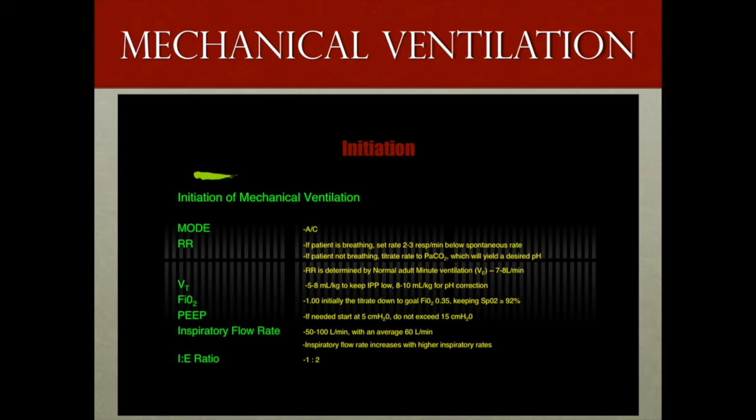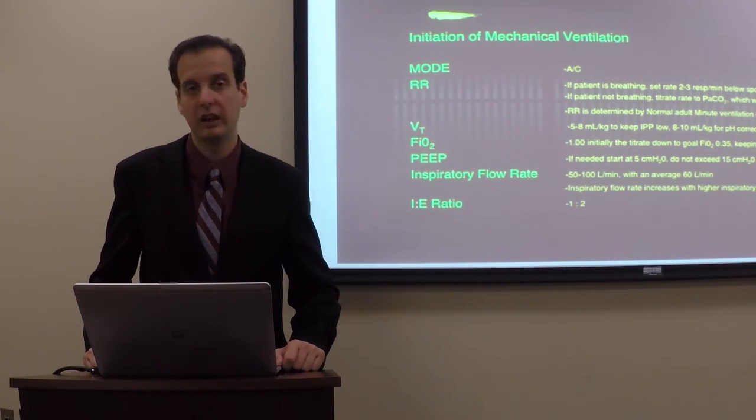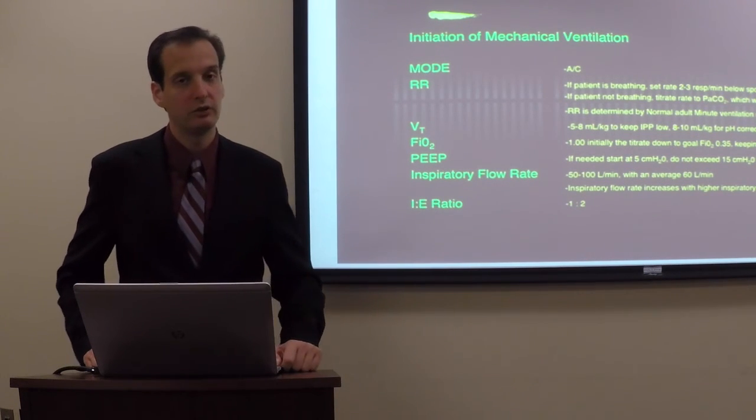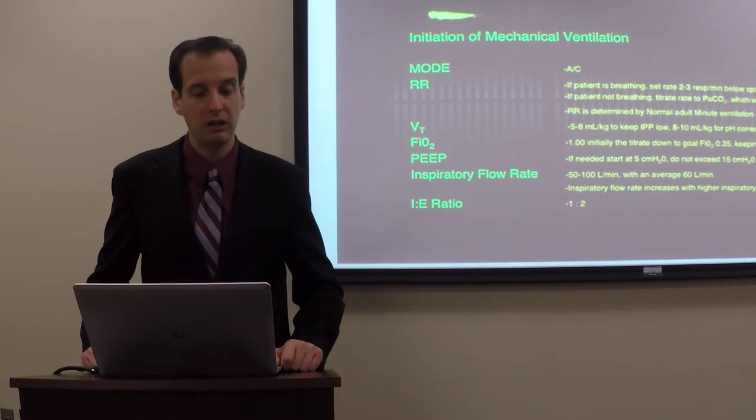Either way, you should be familiar with these settings. The mode you want to select is assist control, and you want to do this because, again, it is a low work mode of ventilation, and it can be used in patients who are heavily sedated and paralyzed, which if they've been recently intubated may be the case.